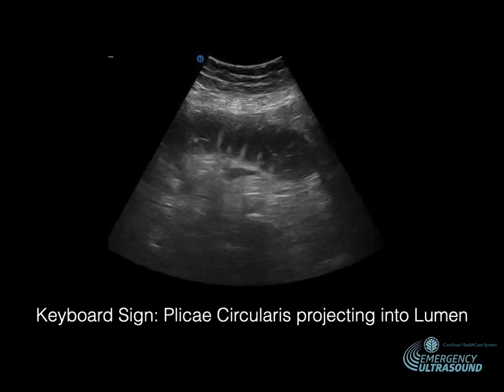So you can see it a little bit better right here. If you look closely, there we go. You're seeing the plicae circularis. Those are projecting into the lumen. It looks like fingers reaching into the lumen or a keyboard.